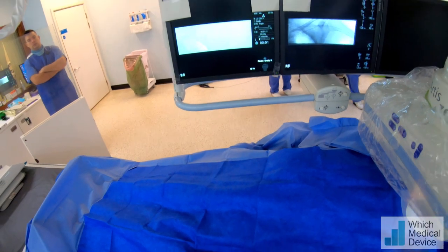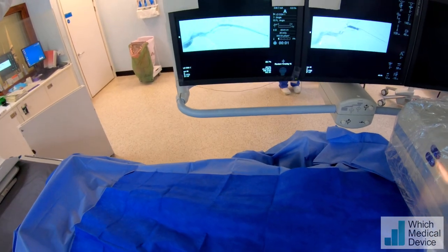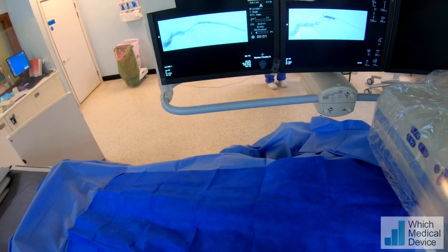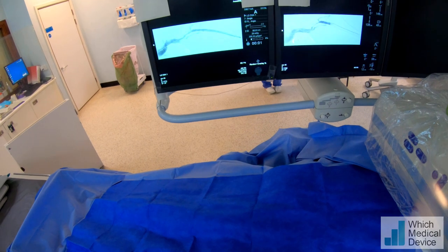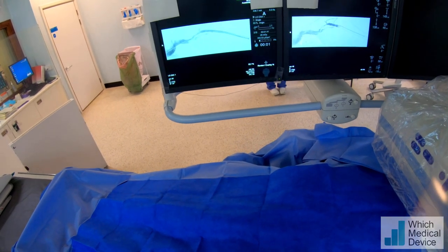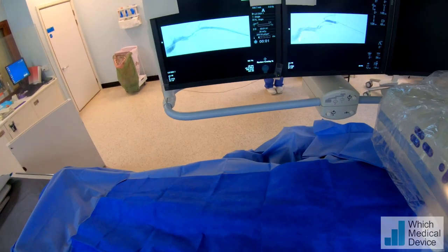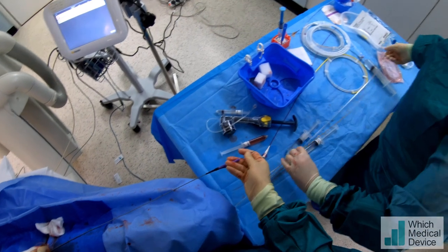That has improved but not sufficiently yet. So we're going to dilate that with a larger balloon and then we're going to place a covered stent. We're going to use a Viabahn stent in this situation because it's a very flexible stent and we don't want anything too rigid where it's going around the cephalic arch, which is an area that does have a lot of flex.